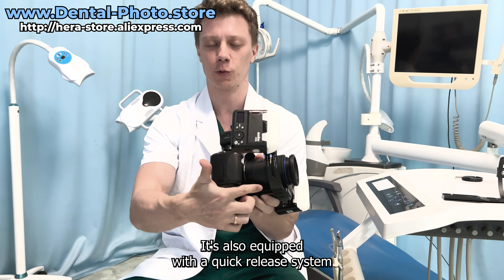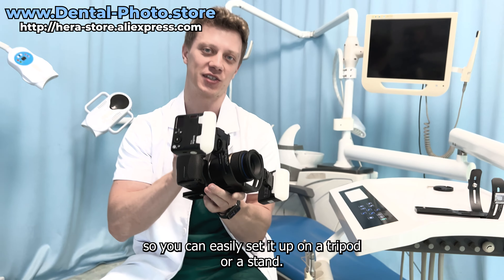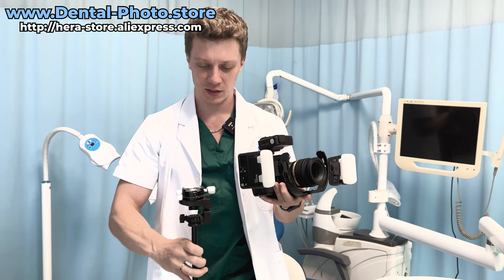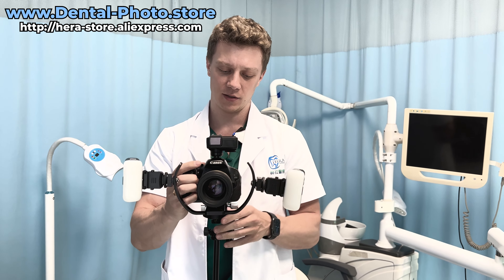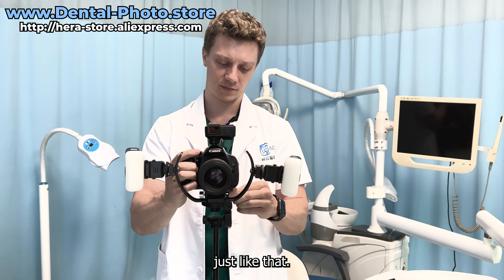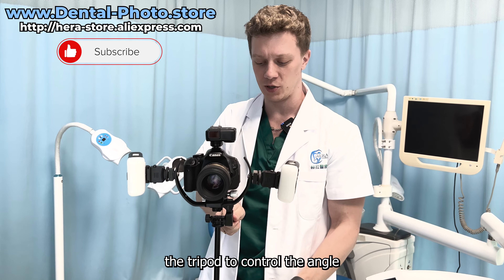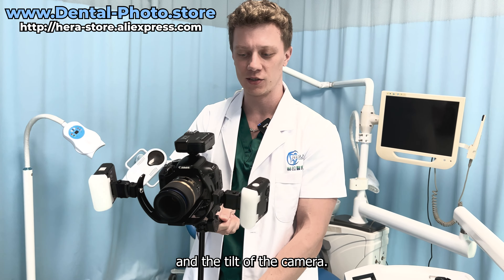It's also equipped with a quick-release system, so you can easily set it up on a tripod or stand. Let me show you — I have a tripod right here, and it takes no time to put it on the stand. Just like that. So now I can easily use the tripod to control the angle and the tilt of the camera.